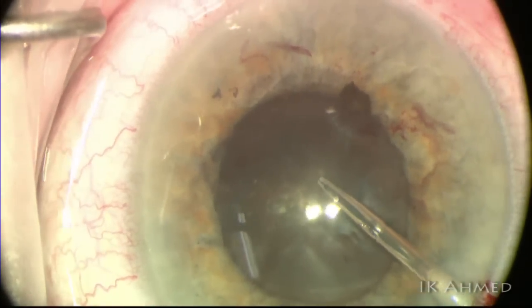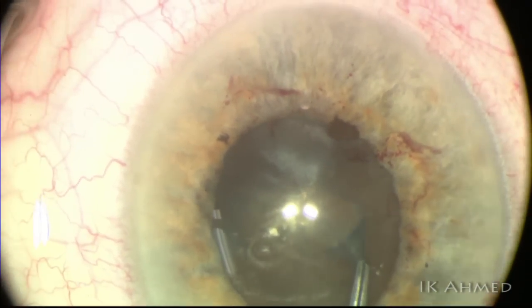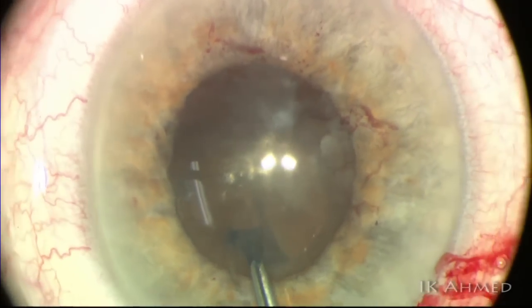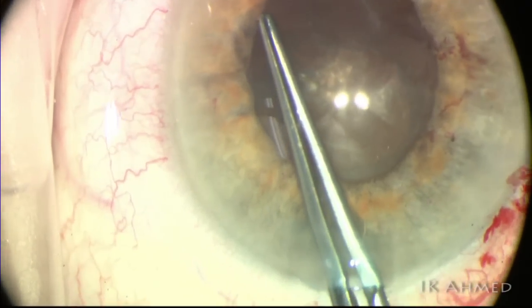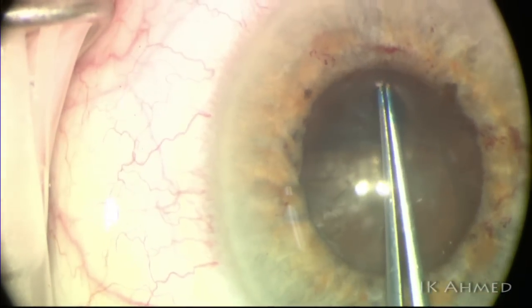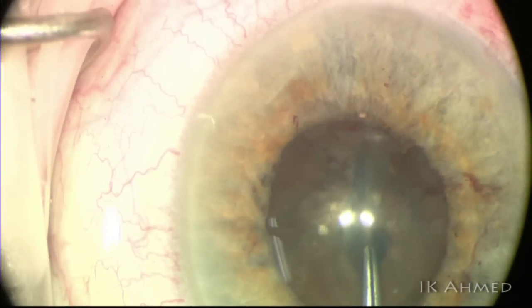We're going to use a pair of micro-graspers and a sharper tip to engage and puncture through the true anterior capsule. The true anterior capsule is now visualized, grasped with the capsulorrhexis forceps, and the flap is propagated. The benefit of the capsular staining placed initially is clear here, along with recognition of the capsular splitting phenomena seen in these patients — including the classic glassblowing cases that were historically reported.